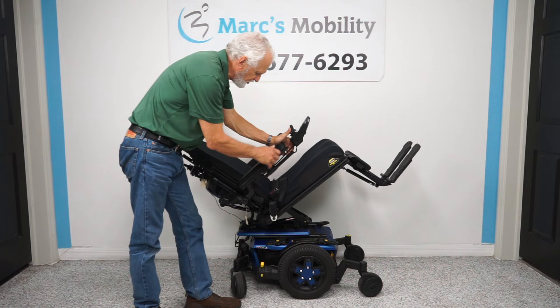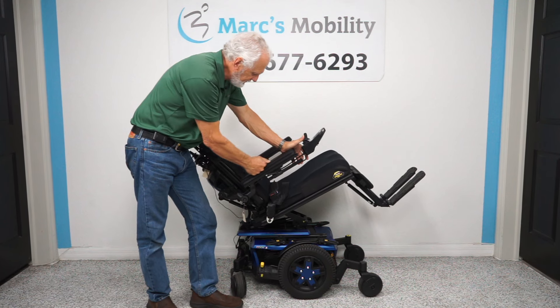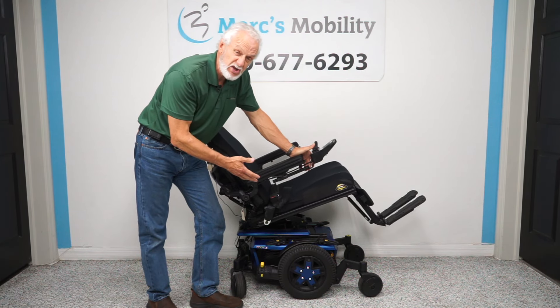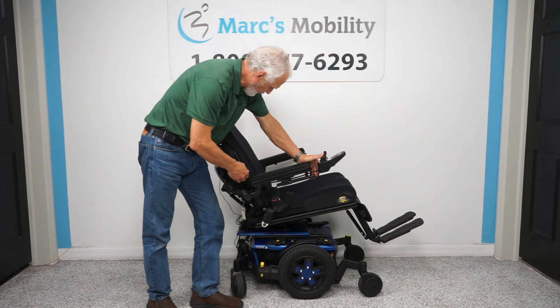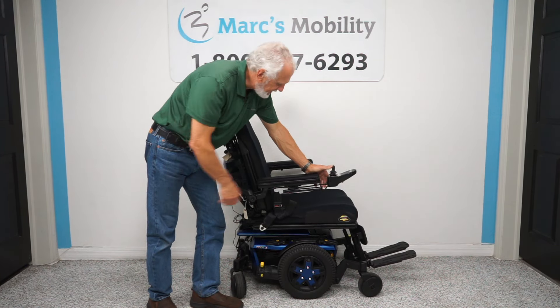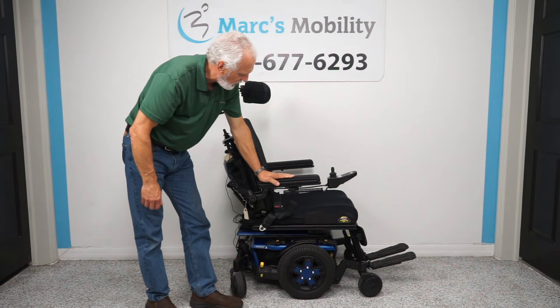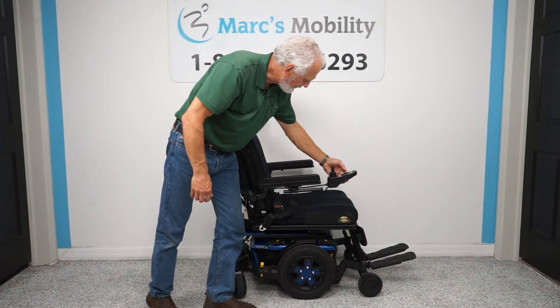The arms on this chair are gel arms, and they look brand new, so maybe this chair was completely reconditioned — that's my best guess. The cushions have not a stain or anything on this chair. The gel arms are on both sides and are custom arms.